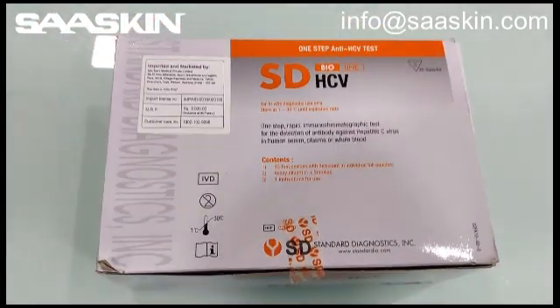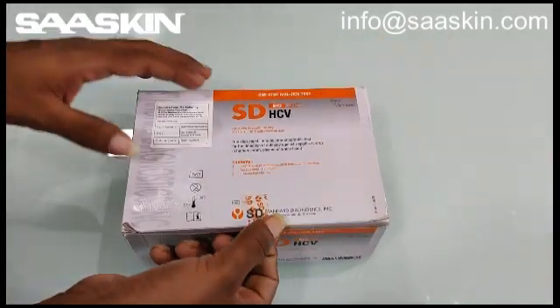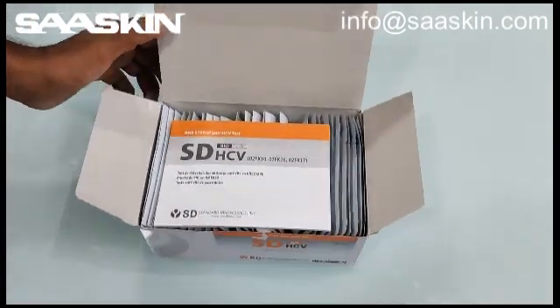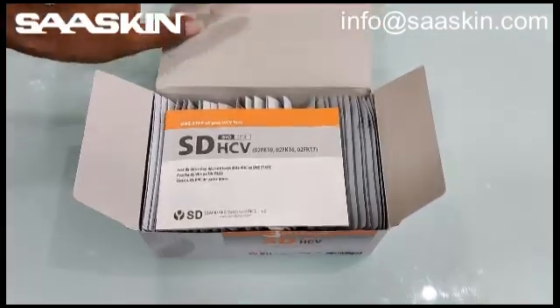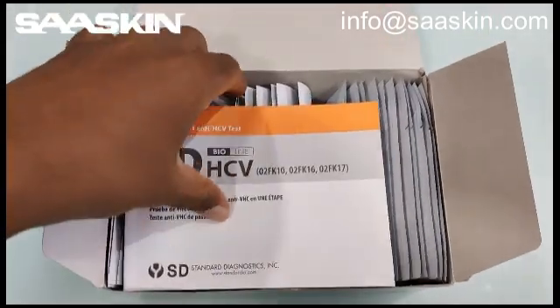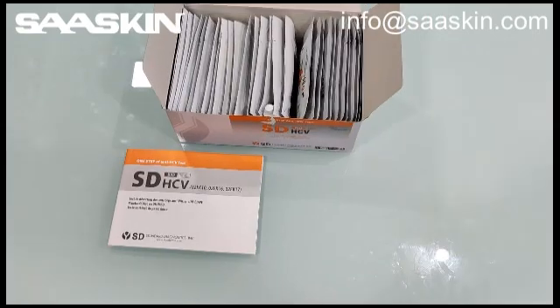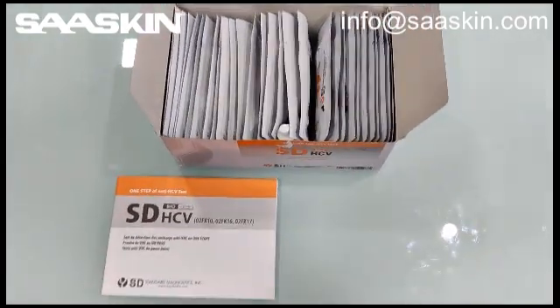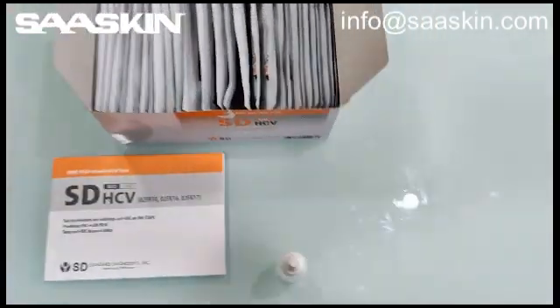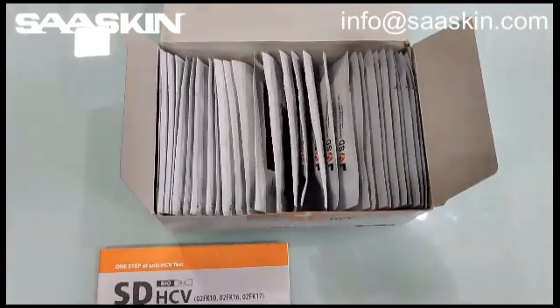Let me quickly unbox this to show the contents inside. This box contains one instruction booklet — it's more like a booklet, as you can see here. There's also one buffer solution inside. And you have 30 test cassettes — let me show you the test cassettes.